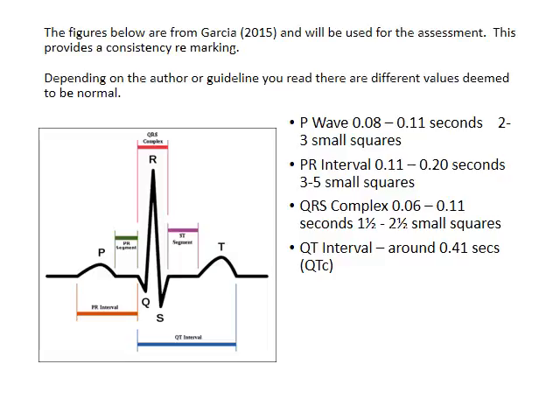Now, for the purpose of this module, we are using the figures from Garcia 2015 edition as the reference range. Different publications will vary slightly. However, in your analysis and particularly your exam, you should use these figures as your reference ranges.